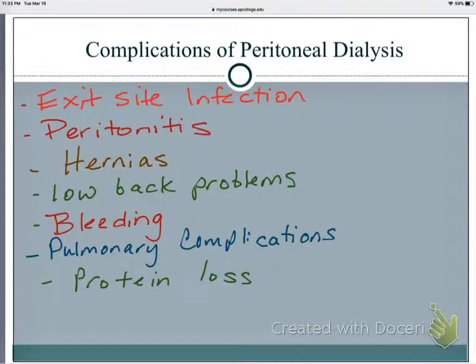So that's something that we need to address. Okay. And sometimes after the initial puncture, when you initially get the catheter put in, there may be a small amount of blood, but it should go away after that. Right? So it could be pink tinged effluent, but then after that it should be cleared up.